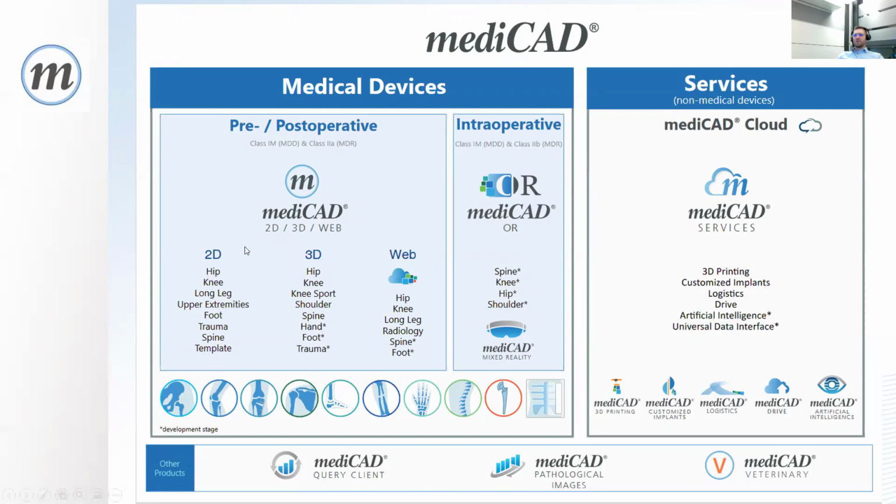You can use 2D data, X-ray data, and 3D data like CTs, MRIs, etc. to plan your surgeries. And we also have a web module, where you have web access to our modules. So this is the first part.